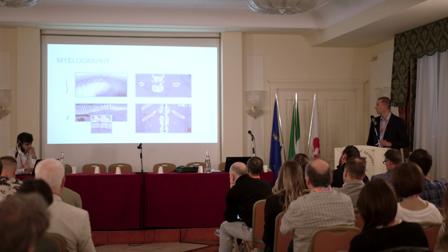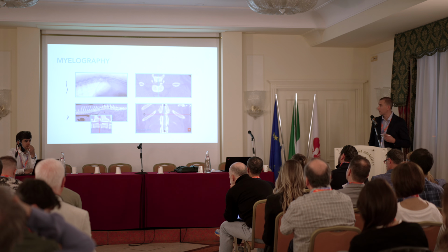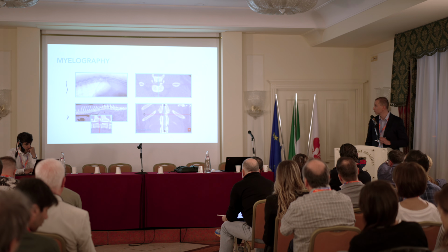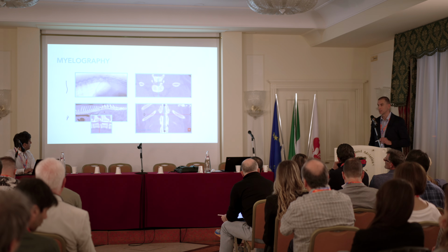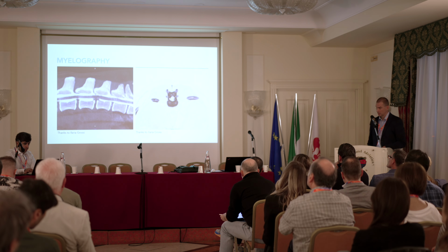So you can see there is very lateralized disc extrusion. It was TH12, TH13 disc extrusion. So this was also surgical case.